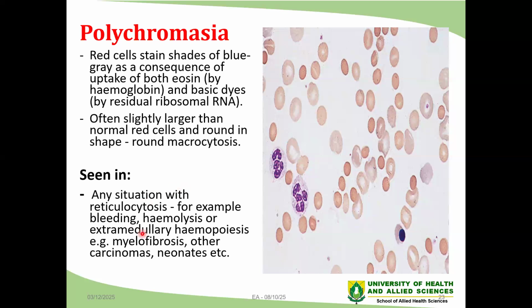All right. Like I did mention earlier, you might come across this situation. I just saw something I quickly want to make reference to. We can see over here, there's a cell which has a nucleus in it. This is a nucleated red cell. And then these are polychromatic red cells. Realize that the color of the hemoglobin in them is a bit different from what we see in these other cells. And then we also see that these cells here seem to stain more deeply. They have lost their central pallor, but I'll talk about them in reference to another abnormality.